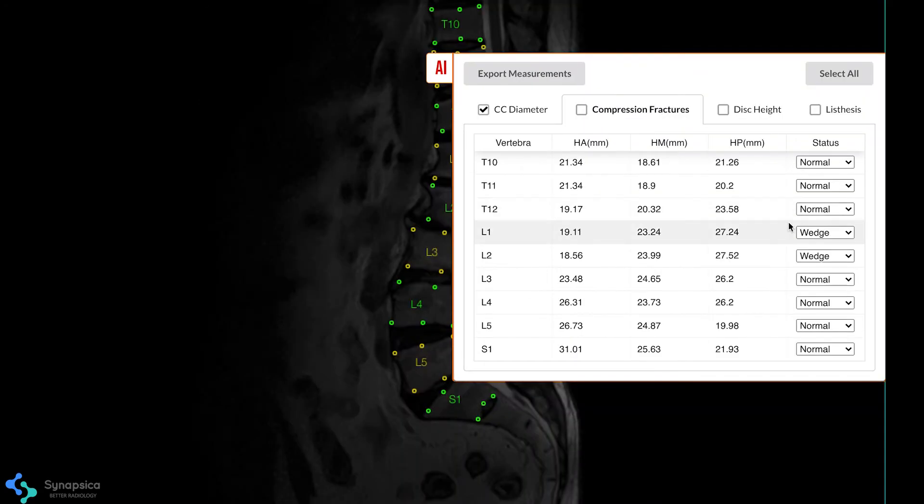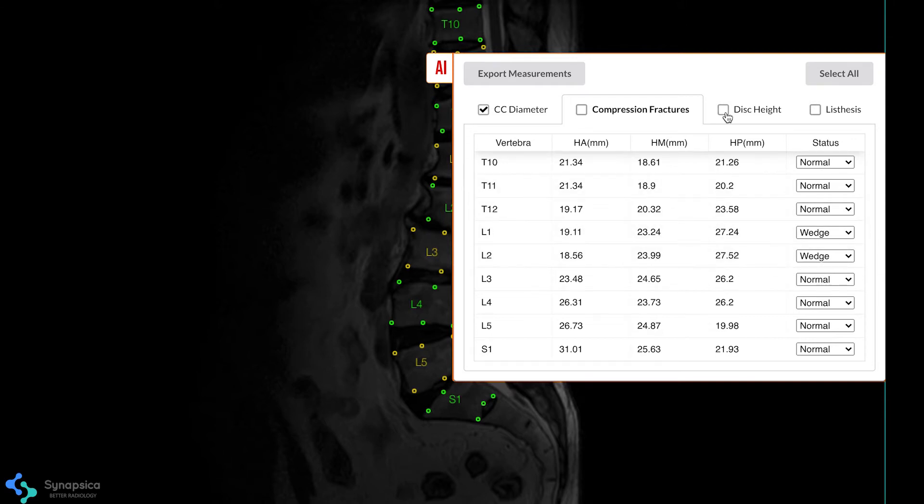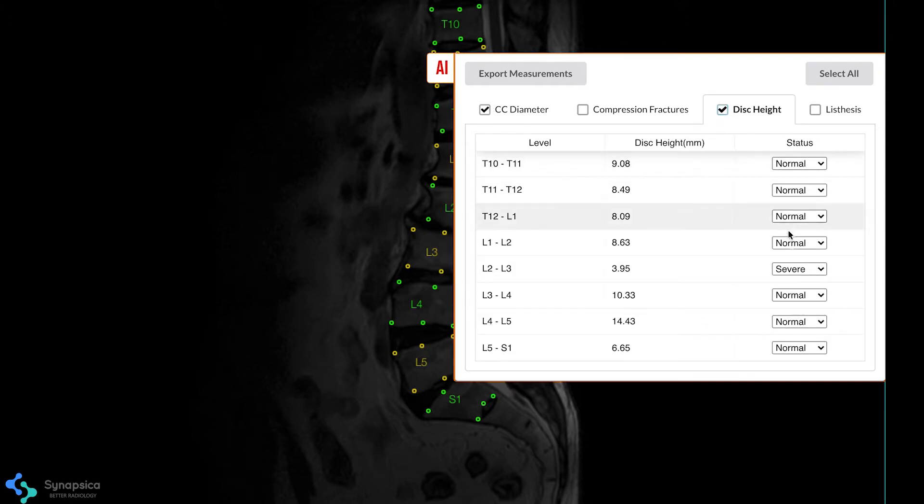Spindle also detects compression fractures and measures intervertebral disc heights to detect any degeneration.